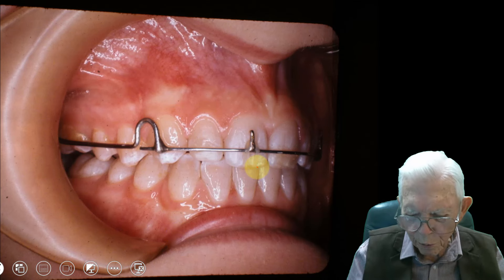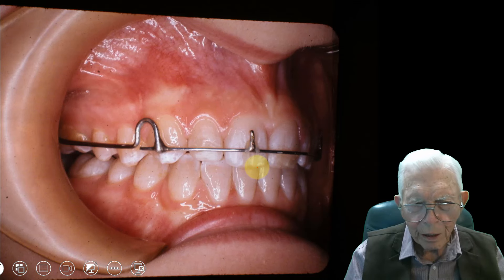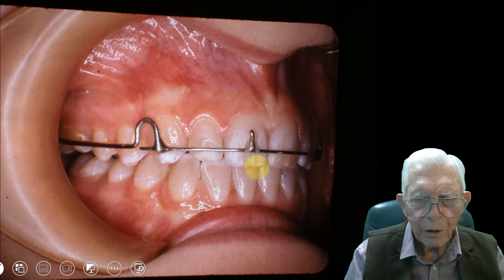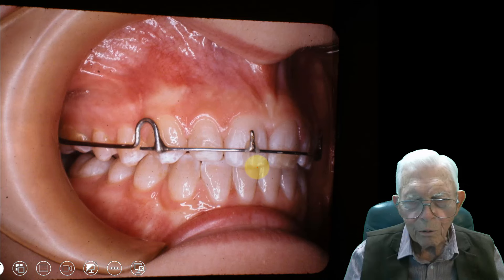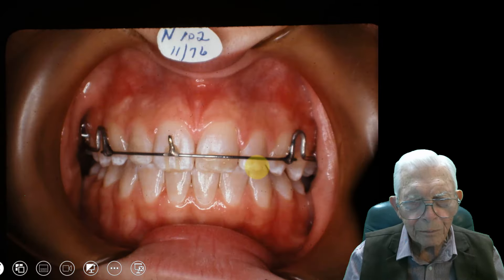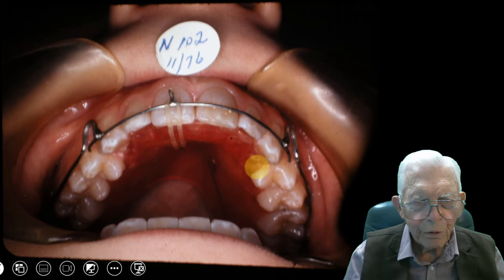These are just things you might do to finish a case. If you wanted to make shells and put it in the correct position, you could do this with Invisalign — but we figured out how to do it without, and this is from 1976. We intrude that tooth in that manner: put a hook in there, and every time they put the retainer in, that rubber band pushes on that tooth and moves it up. There it is later on down the line.